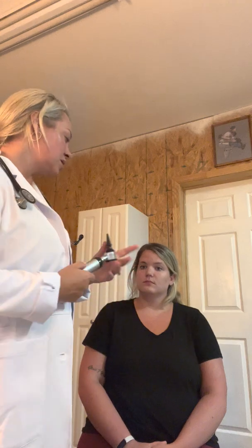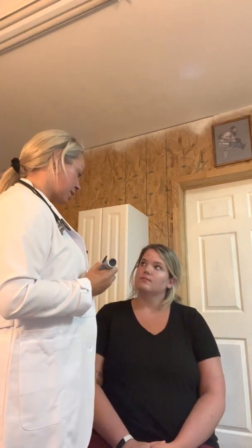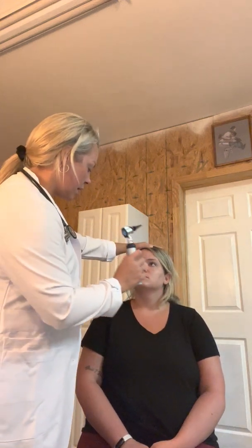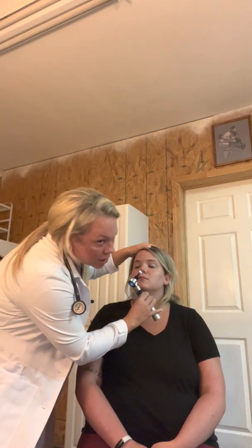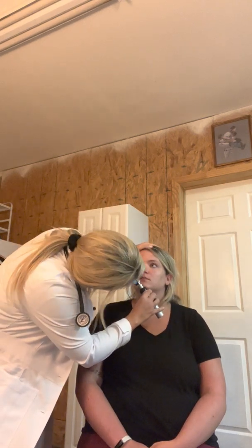Okay, Melissa, so now I'm going to inspect the inside of your nose using the otoscope. To do that, I'm going to use my dominant hand and insert the speculum without actually touching your septum. I'm going to use my non-dominant hand just to hold your head steady. I'm just going to gently put it in your nose, again to not touch the septum with my speculum.